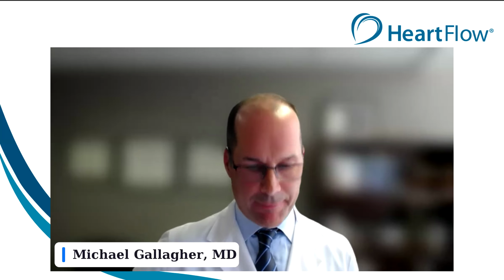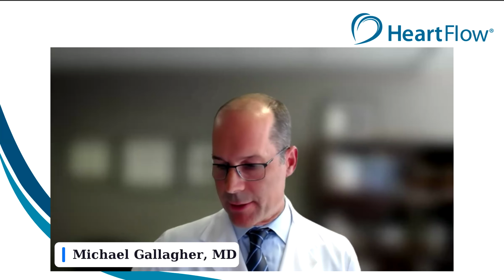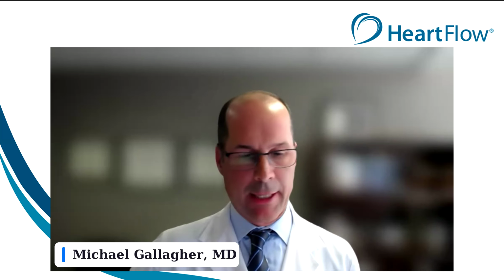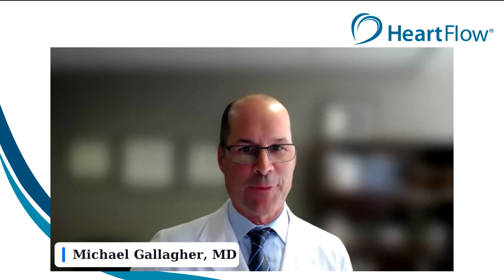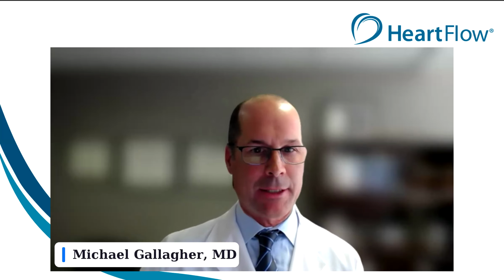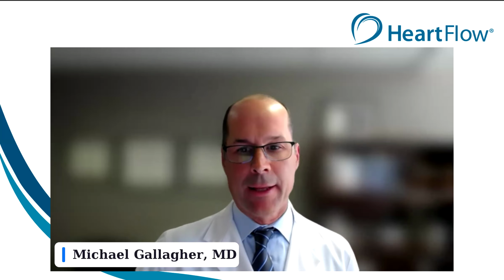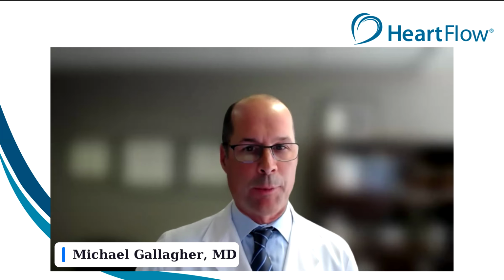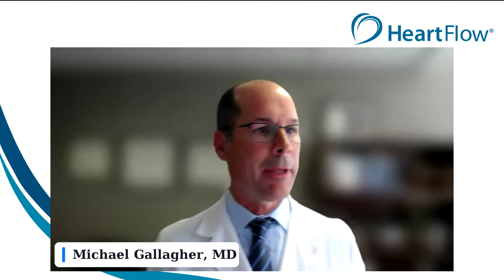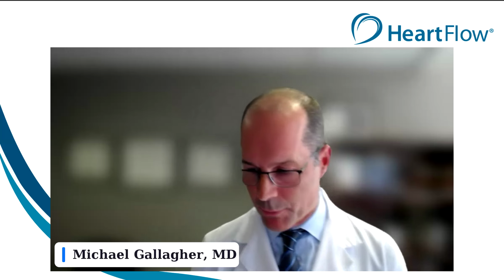And I guess the first thing to reflect back on what Ron shared is that I do think reproducibility and accuracy are very important. Even you and I and others have intra- and inter-observer variability, and even with something as simple as a P0 through P4 staging system, I think we often may disagree. So I very much welcome this quantification to integrate into a very well accepted CAD-RADS 2.0 reporting tool. And I think it lends itself extremely well into a recognized and adopted reporting system.